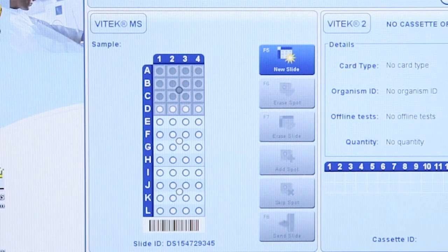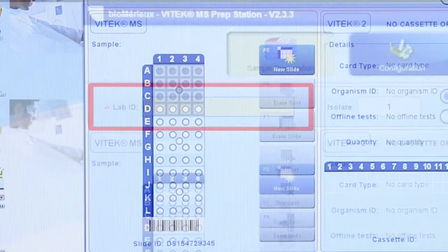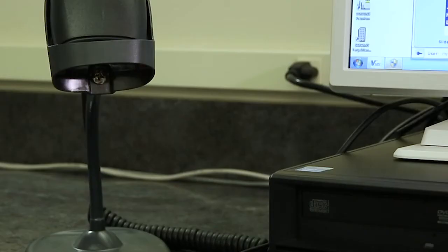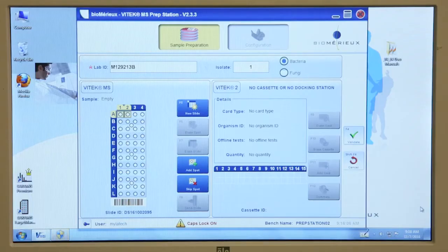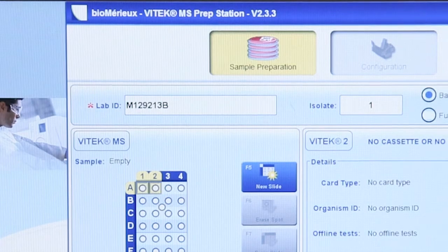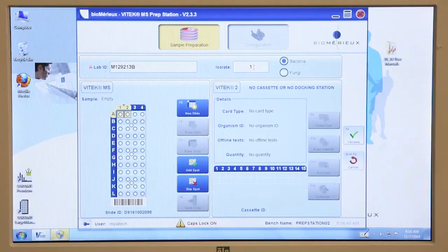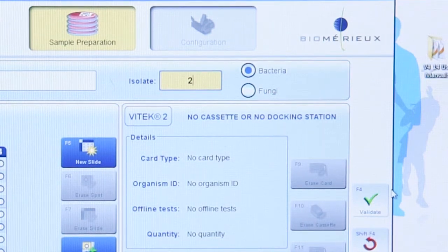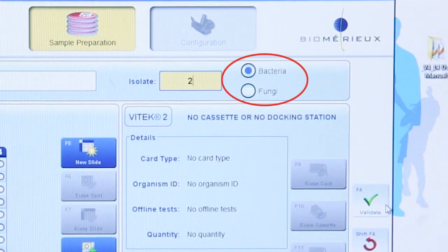No additional testing can be performed in a blocked group. In the LabID field, scan the accession number barcode on the culture plate with the barcode reader or enter the number using the keyboard. If necessary, change the isolate number in the isolate field. Verify the correct organism type — bacteria or fungi — is selected.